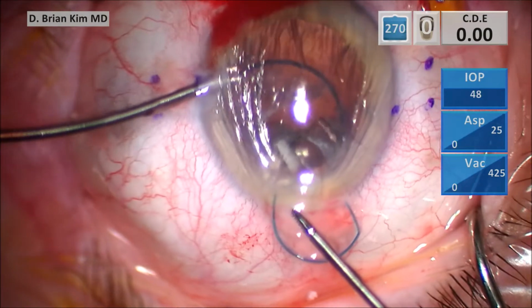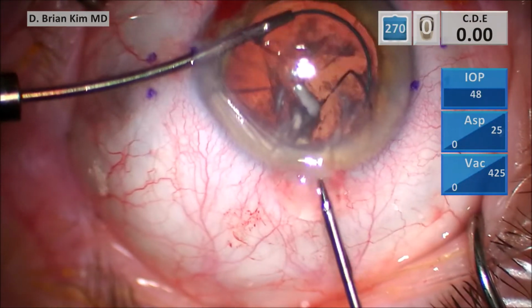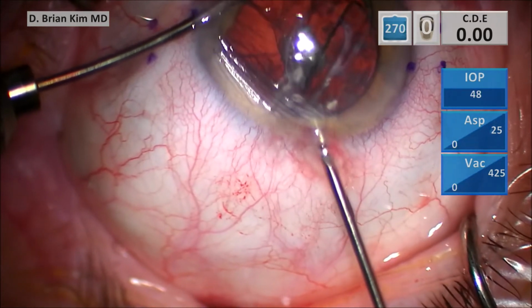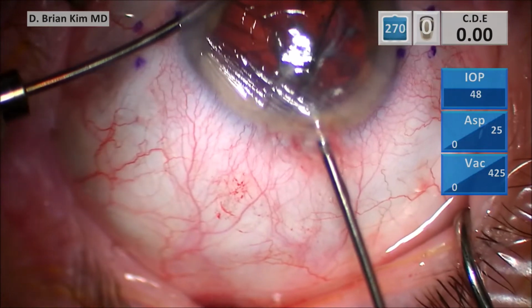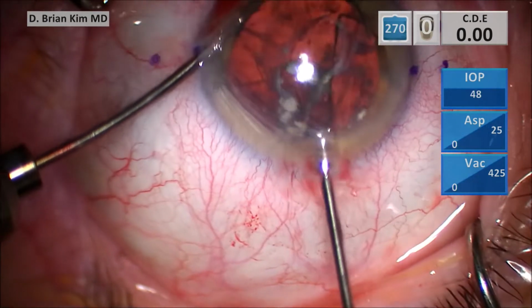So again, pulling the lens out with my right hand, and then holding the leading haptic with my left hand just to secure it in place. And while I'm holding the leading haptic, now as I'm turning the eye away from me, I'm trying to grab the edge of the optic.